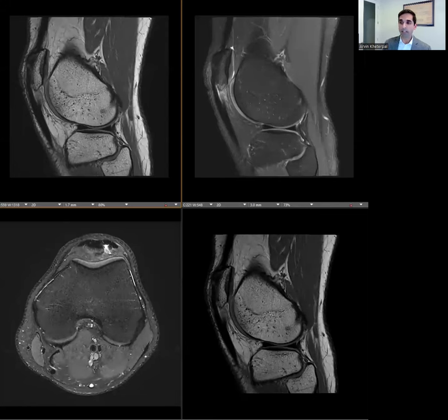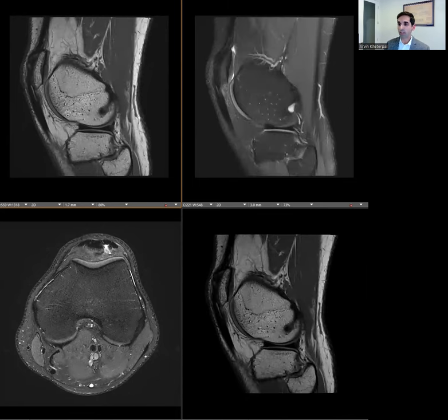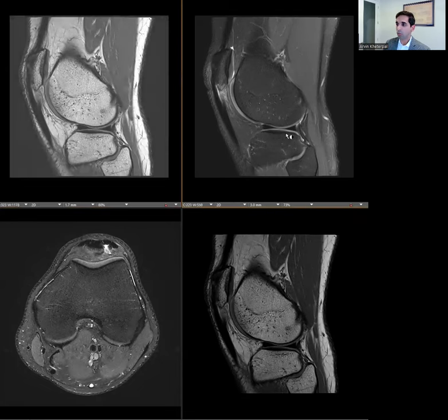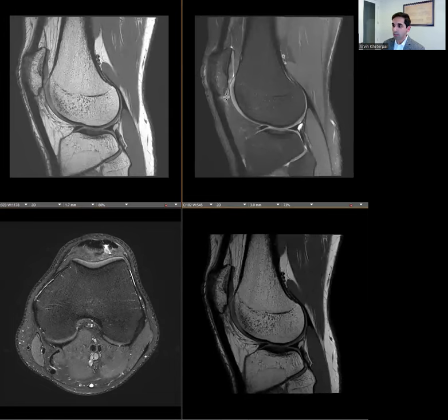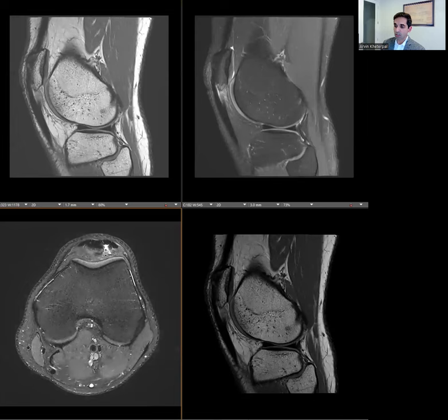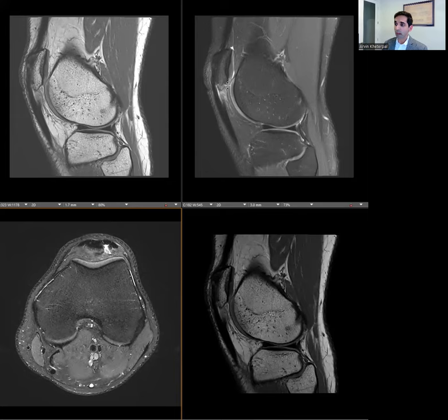Let's take a look at another case. This is a 19-year-old male basketball player presenting with anterior knee pain. When we scroll through the patellar tendon, we see that proximally there is some increased signal — it seems pretty focal on the axial images. We can see it's quite focal, and the high signal is fluid signal — the same signal intensity as the thin fluid in the joint.